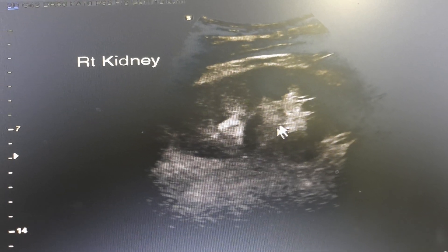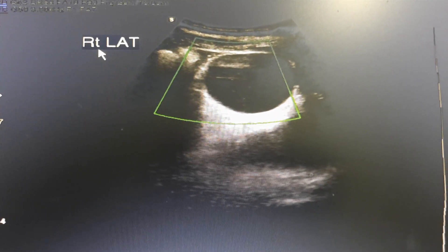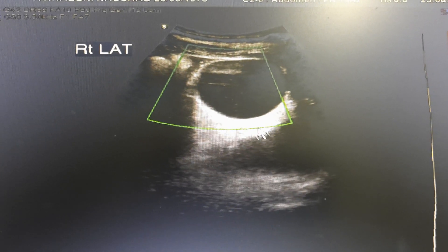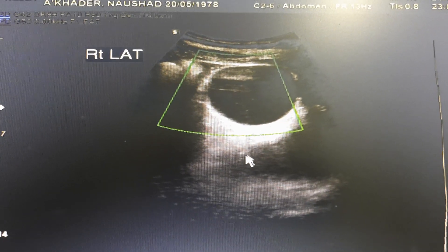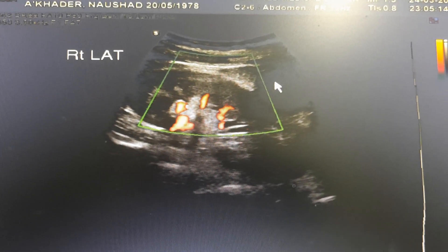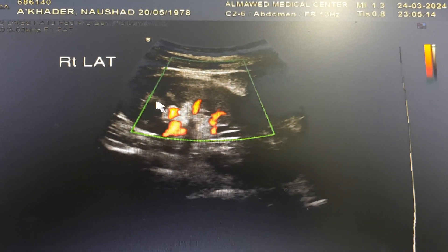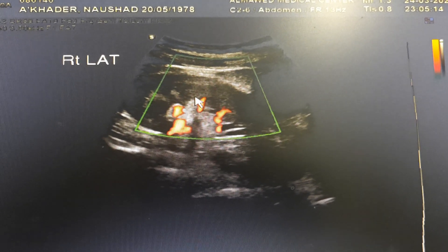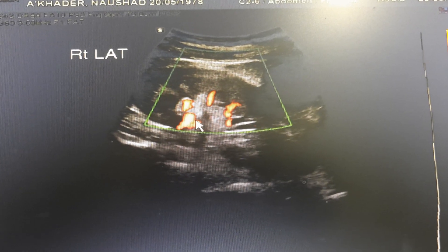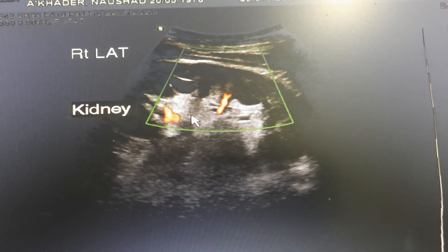This is the whole anatomy of the right kidney. I go back right laterally — this was the one in the liver. Then right lateral, I show because maybe it will be in the kidney — but it is not. Okay, right kidney.